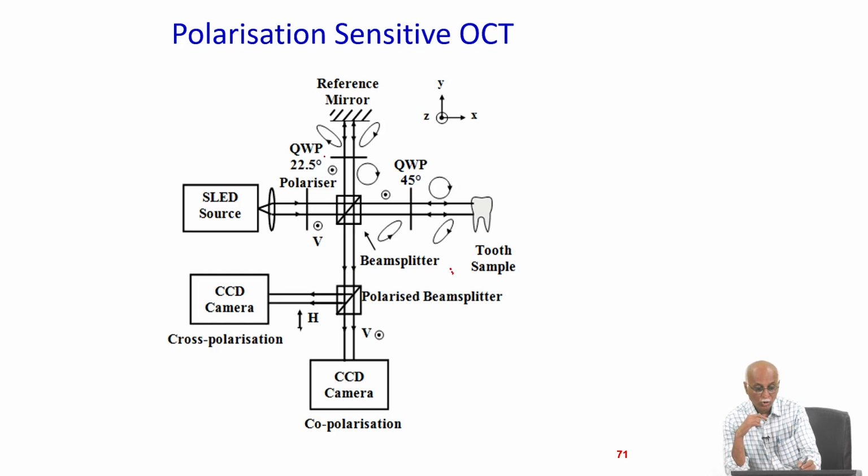So, this wave which is travelling through will have vertical and horizontal components, but amplitude may change depending upon the orientation. It will get converted into an elliptical wave, but when it passes back again, it will become circularly polarized. And the rotation will be in the same direction.